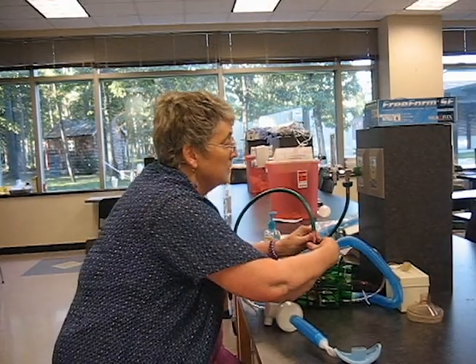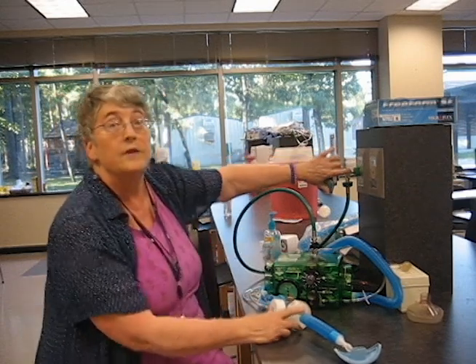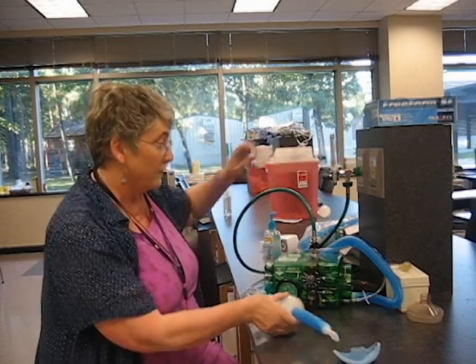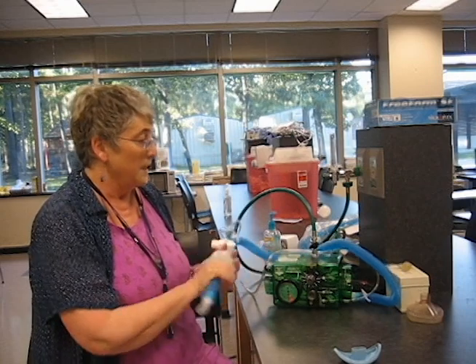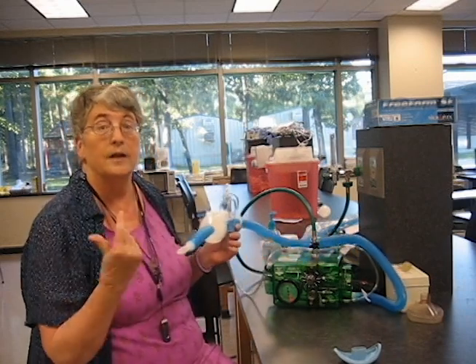The first thing we're going to do is tighten our leaks because I hear a leak down here. This should be running 50 PSI off the wall, not on the plumbing. Now I'm going to take a good treatment first, and then I'll show you how the patient can make problems, and then how you fix it.